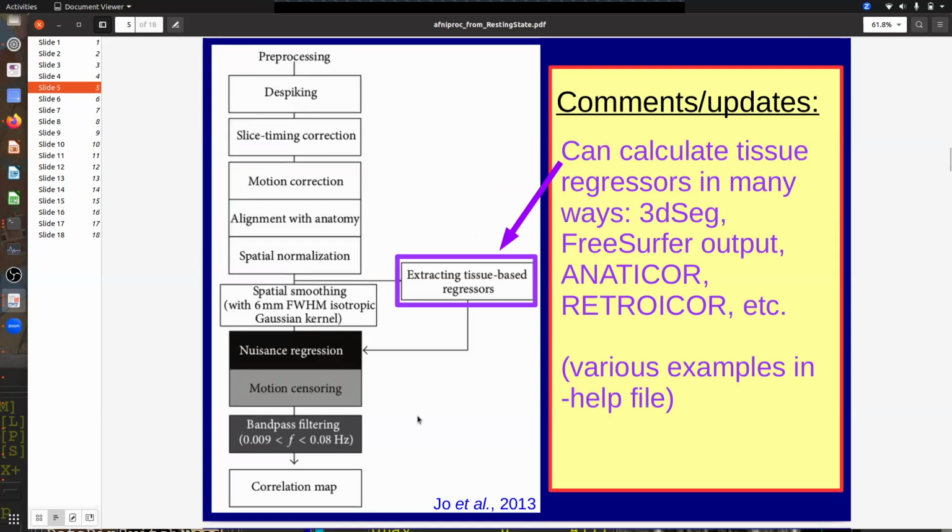Okay, and there's a lot of different ways that you can try to get rid of extra things in your data that you think aren't related to brain activity. So subject motion is only one of these. There are a lot of other things in fMRI that affect your data, and affect it in the sense of what you want is blood oxygenation response specifically related to neuronal firing.